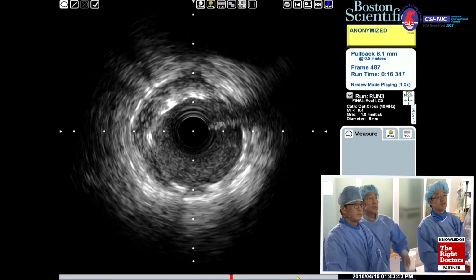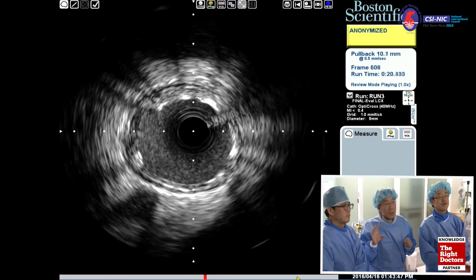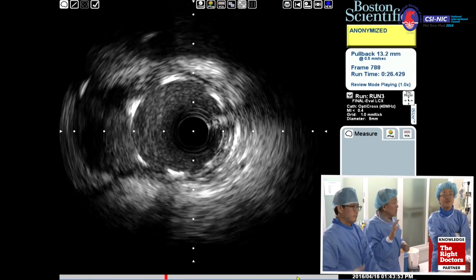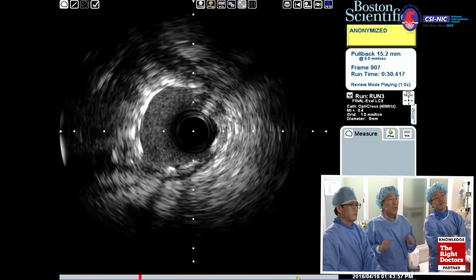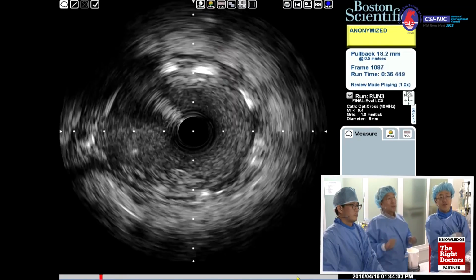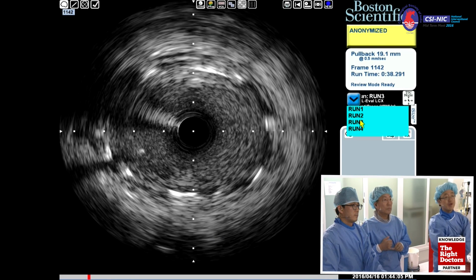All right. Look at this. Stent diameter is almost 3. The meaning is stent area is almost 7 millimeters square, right? And we have some cutoff value, which is 5. So compared to that, it's big enough, 7 millimeters square. This is the confluent area, and it is big enough. Okay, and then we already checked the left main LAD.